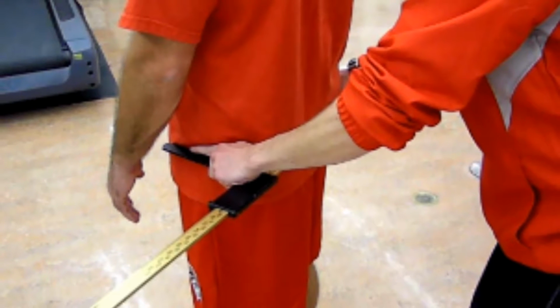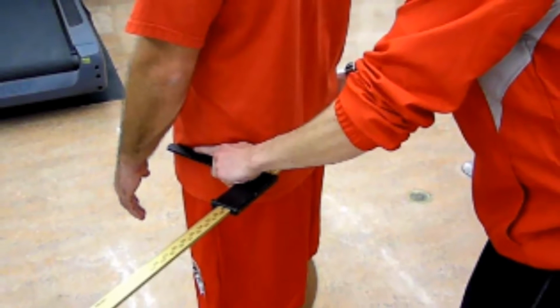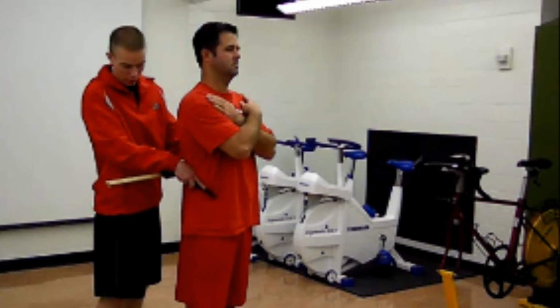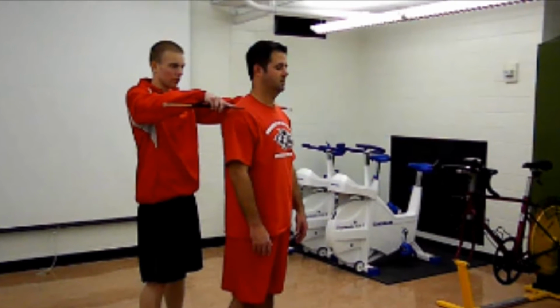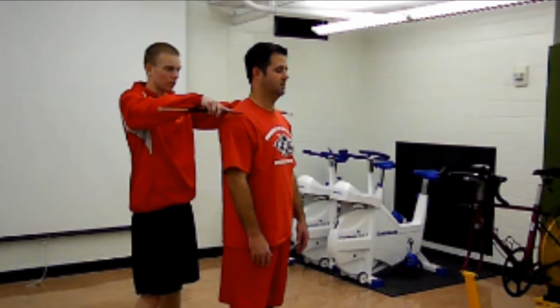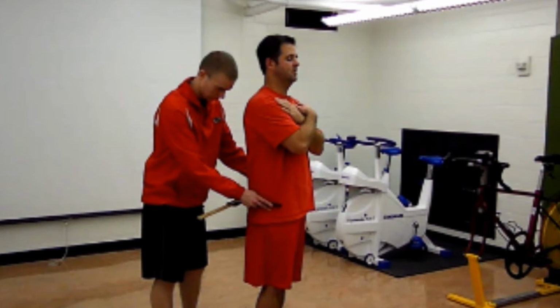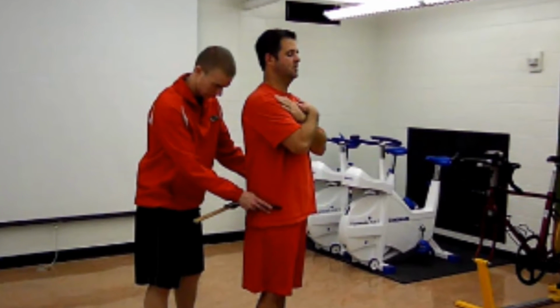When assessing body segments with a larger girth, such as the bitrochanteric, biiliac, or biacromial, a larger skeletal sliding anthropometer should be used. Again, measurements at various sites should be taken in a rotational order at least 2 or 3 times, provided the values are within 1 centimeter.